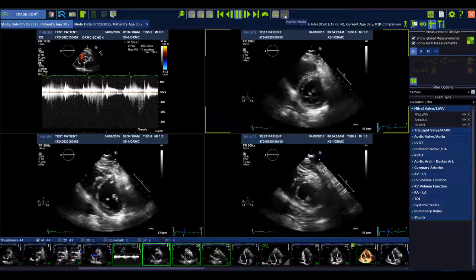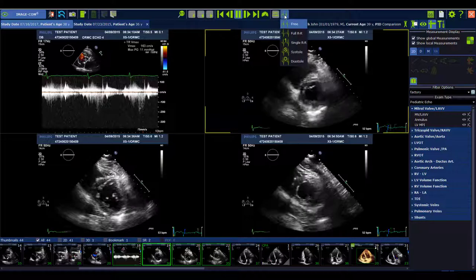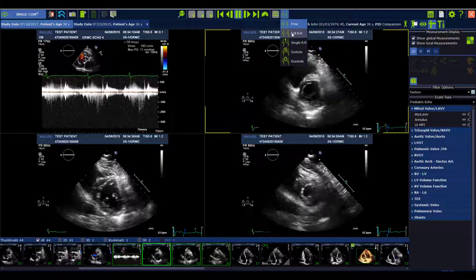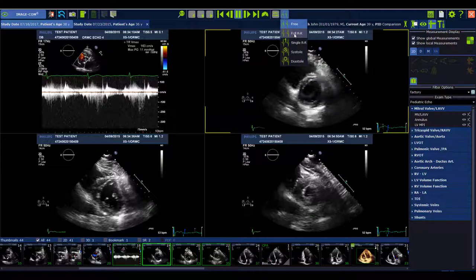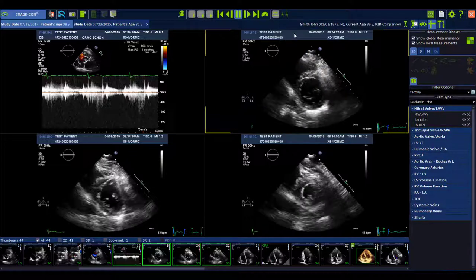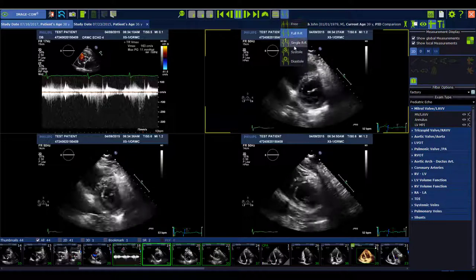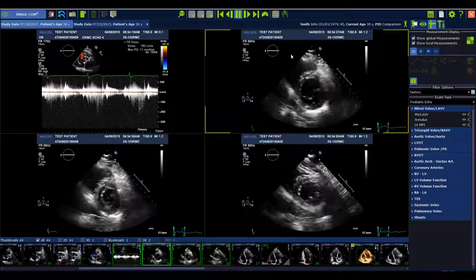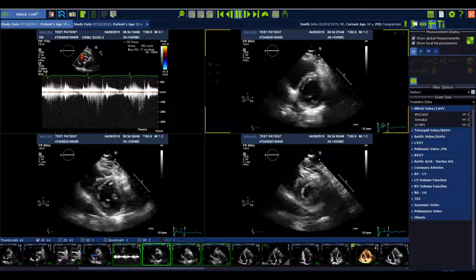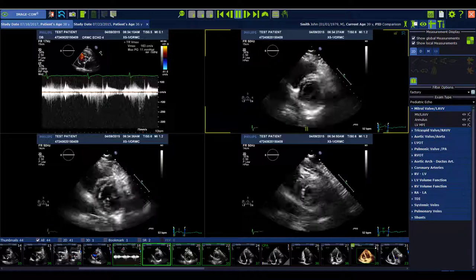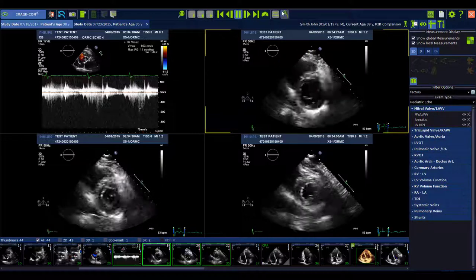ImageCom now also offers easier clip boundaries management. You can select whether you want to play the clip just from R to R, just the systole, or even just the diastole.